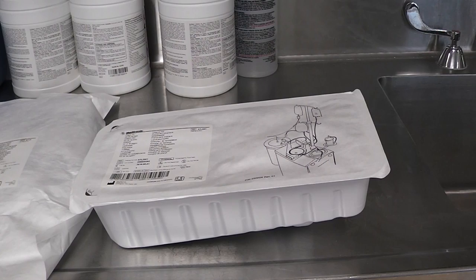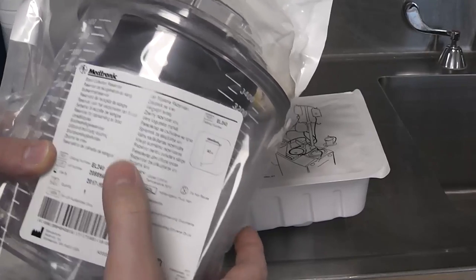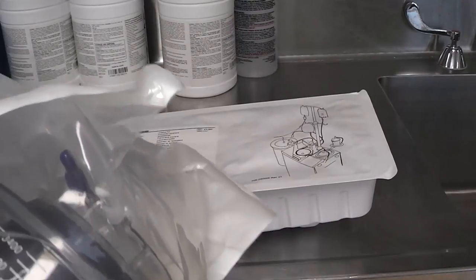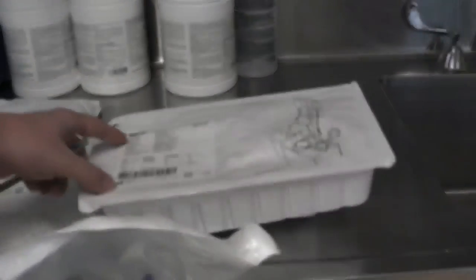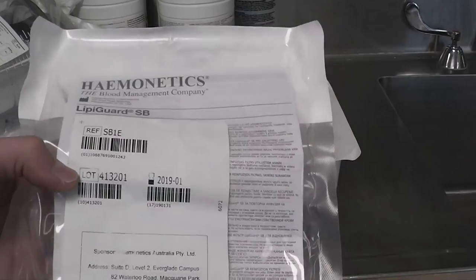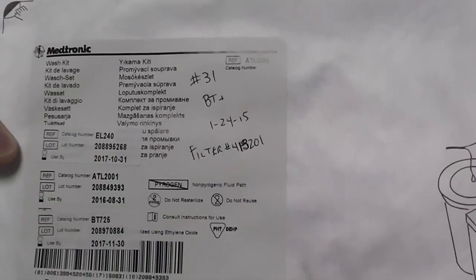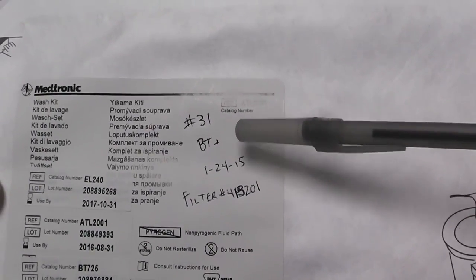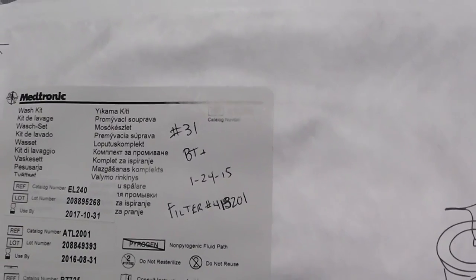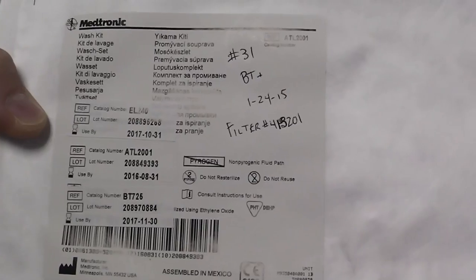Now that we have gathered the needed disposables, we need to properly document the lot numbers. We will do this by removing the stickers with the lot numbers on them from the reservoir and the table pack and putting them onto the label with the wash kit. Now we will write down the lot number from the filter, our initials, the perfusionist that we are with, the number of the cell saver which is on the back of the machine, and the date. The final label should look like this.